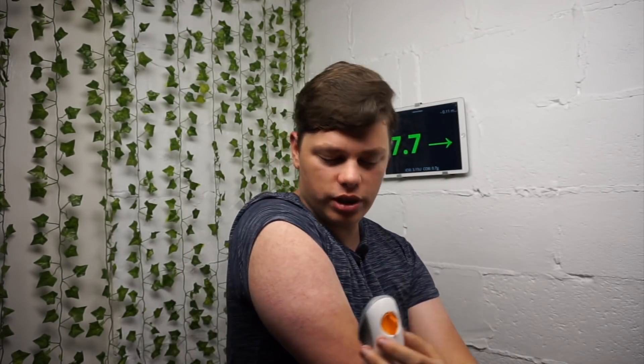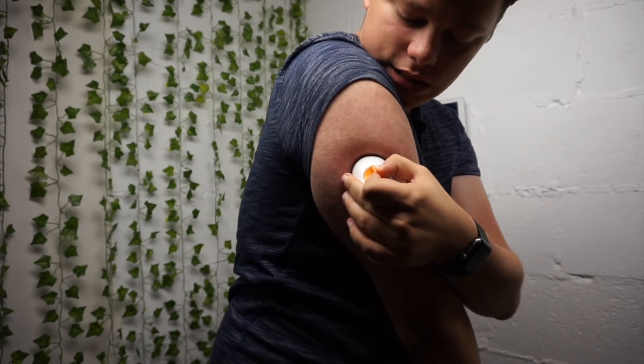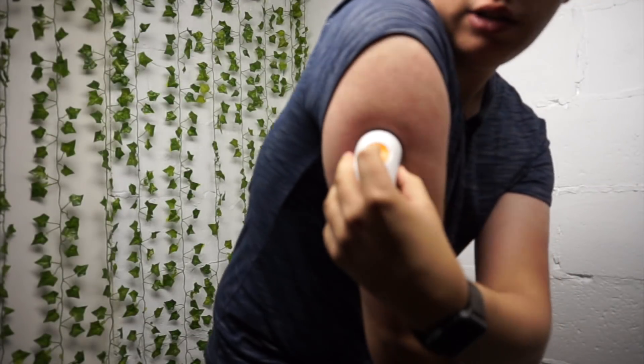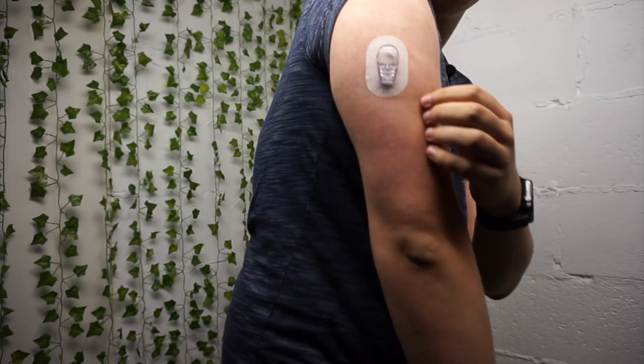I've been using my arm for like two or three years, so I am not experimenting with my stomach. This is apparently quite easy — you just do that, stick it like that, and then you twist it. Then you just press it. I'm actually quite scared to do it — okay, let's do it. Three, two, one. Okay, that was okay! You can definitely feel it — a very very quick insertion — and then you can feel the actual needle leaving. So there we go, that's it, that's my Dexcom!